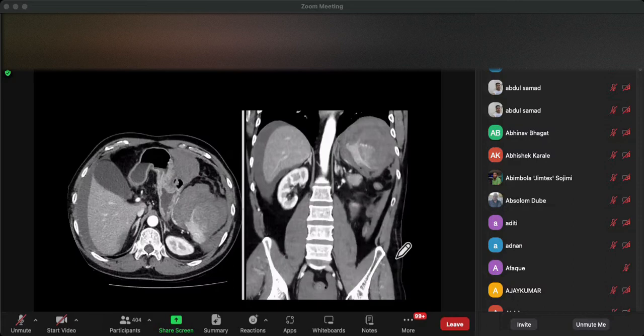Okay, what's happened here? Patient is in shock. How do I know the patient's in shock? Well, they've got bright adrenal glands, so very dense attenuating adrenal glands, meaning that the patient is hypotensive, and they've got a spleen that is ruptured with hematoma around the spleen, and they've got hemoperitoneum.